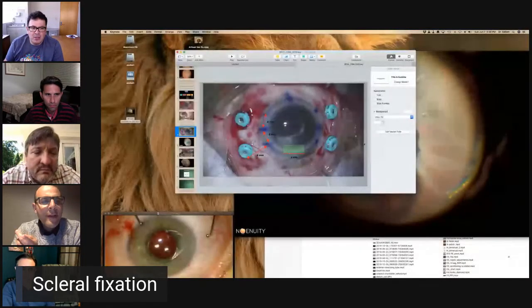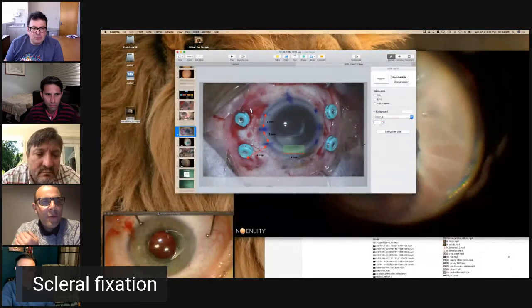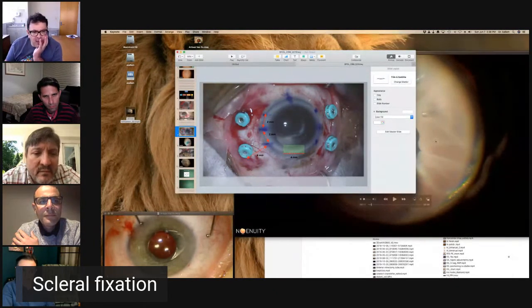Does it affect the final refraction if the lens is 4 millimeters back? It depends on which one you use, right? So I use the IOL in the bag calculations. Okay, as if you're putting it in the bag.